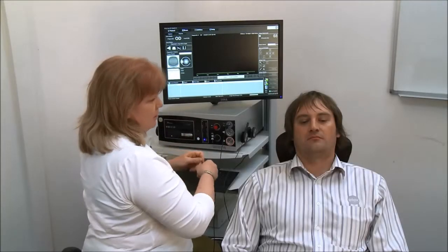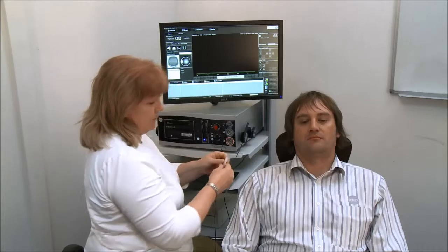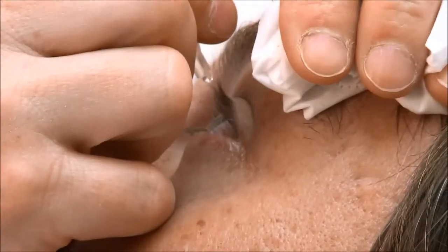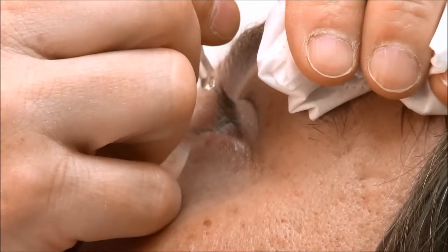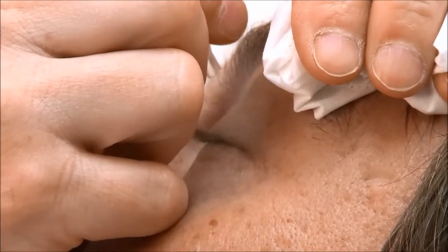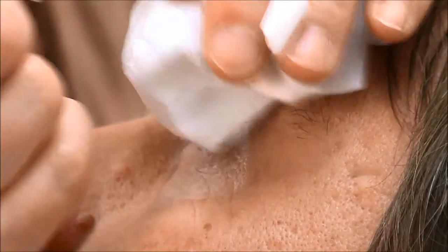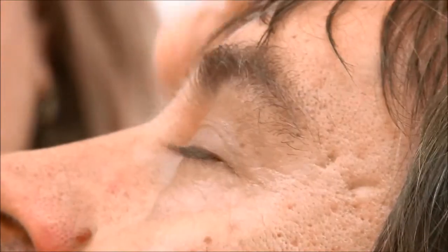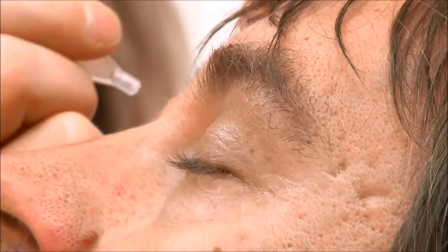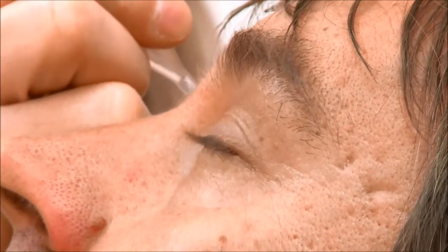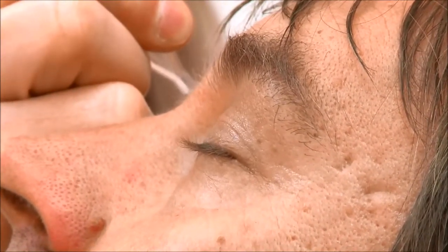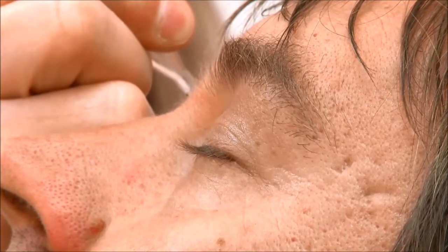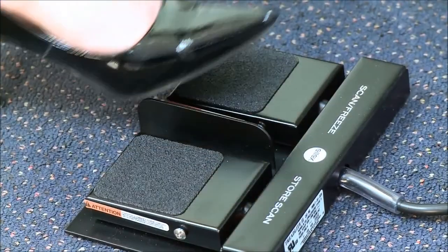Local anaesthetic drops are applied to the eye to be examined. Note that many times both eyes are dropped to deter excess blinking. The patient's tear film will usually be sufficient to ensure good conduction of sound beam.